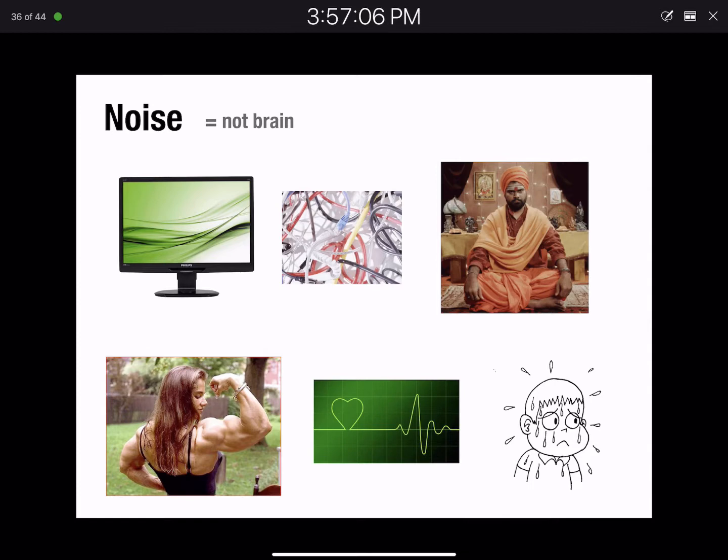Another one is sweat. Extreme example illustrated there. Hopefully nobody in your EEG experiment is sweating that profusely. But even just wearing the EEG cap, your head might get warm, and it might start to perspire a little bit. And that increases the conductivity of your skin, because now you've got this saline solution, basically, sweat, on there. And even in low concentrations, that's going to mean that more electrical current is able to flow across the scalp and interfere and get picked up in your electrodes.